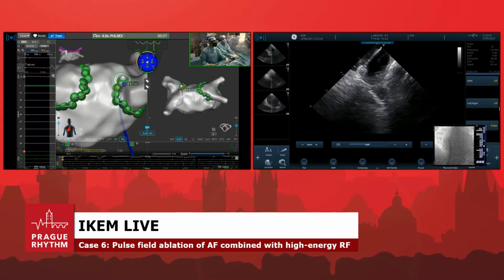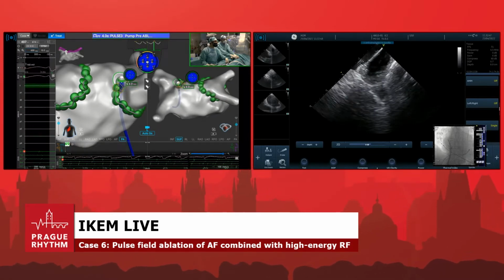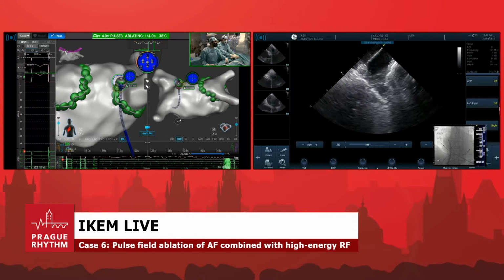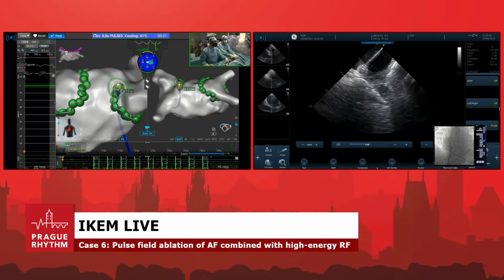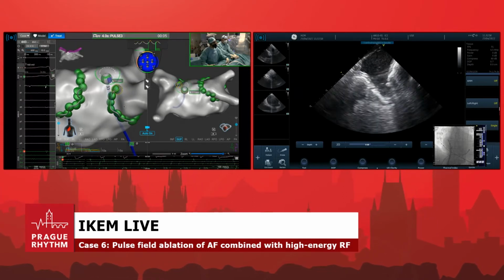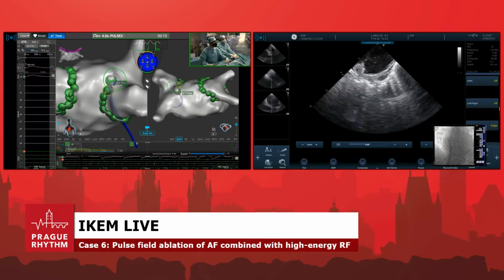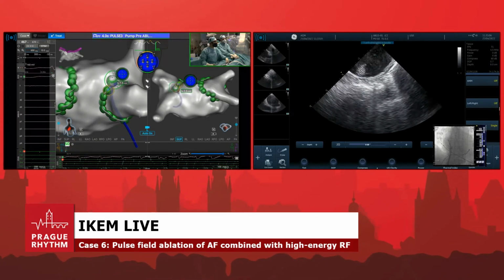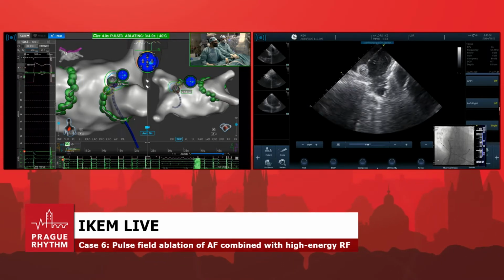Okay, this is perfect. If you remember from yesterday, I'm going to ablate now with PF. Look at the temperature on the catheter. You can see a little bit of changes in color there. That's the minimal heating that you have. It's not thermal, but it reassures us that we're in contact, because the lesion distance that we do is around 6 millimeters here, and obviously it overlaps with already injured tissue.